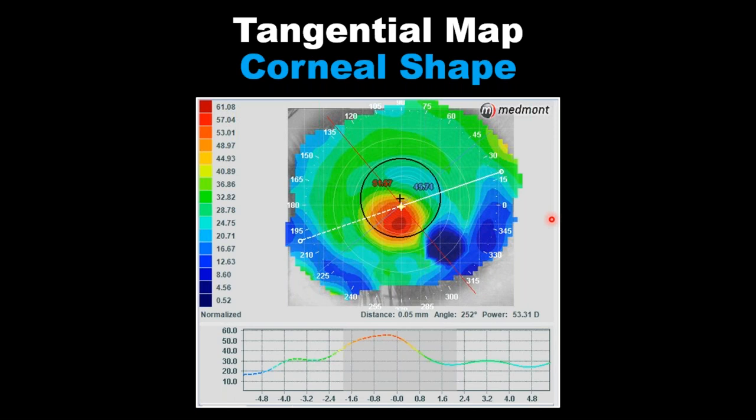Vamos a cambiar ahora a mapa tangencial — el mapa tangencial nos da forma, localización y tamaño. En este caso tenemos la rayita negra que indica la pupila y el mapa nos está diciendo que básicamente ese cono que tenemos en esa área está totalmente metido en el área de la pupila. Si el cono está fuera del área de la pupila, quizás la agudeza visual que puede obtener el paciente sea buena; sin embargo si está en el mismo centro de la pupila obviamente va a ser mucho más difícil.